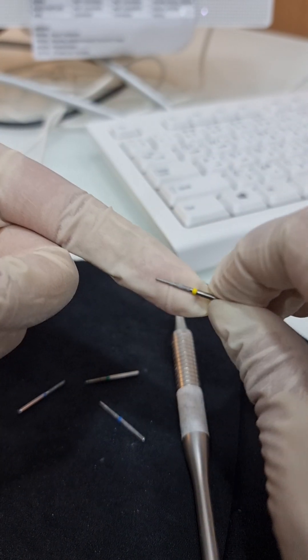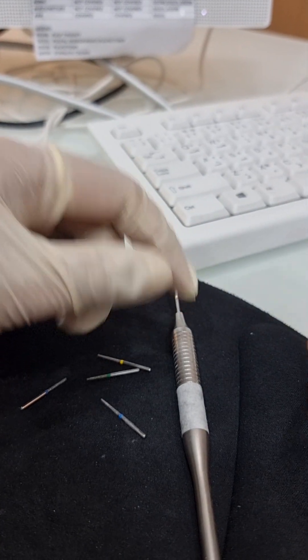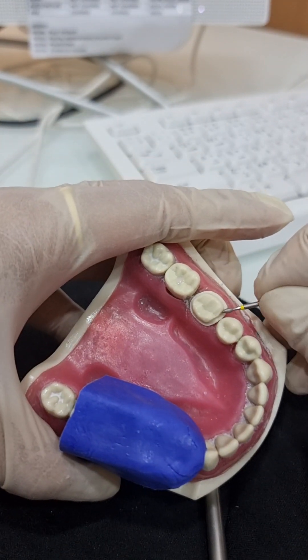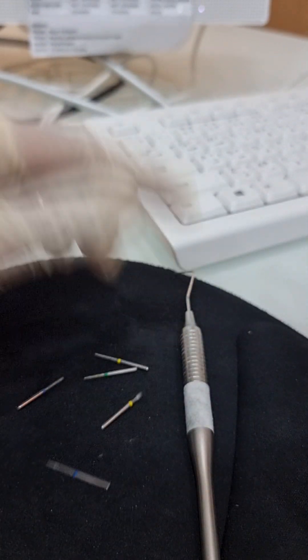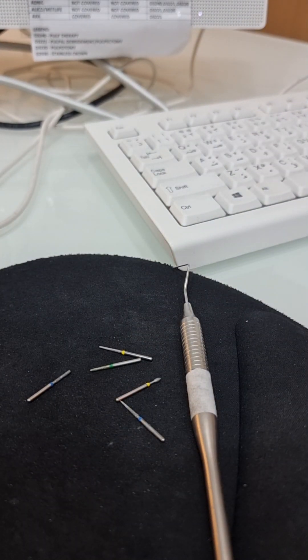This yellow burr is a finishing burr, again for finishing the margins. There is also a pear-shaped burr which you can use for smoothing out the edges. Crown prep mostly requires these burrs.